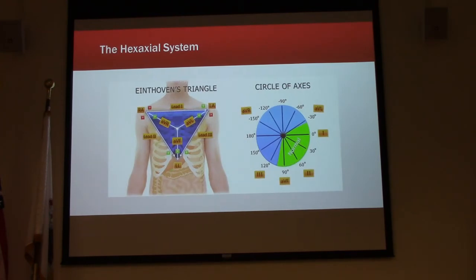When we take a look at our 12 lead, one of the things we first of all teach students is the numbers that print off on the top. We tell them to look at those numbers. They're going to be able to identify the underlying rhythm just off those numbers without even looking at the 12 lead itself. Once they've figured that out, then they can go ahead and take a look at the tracing.